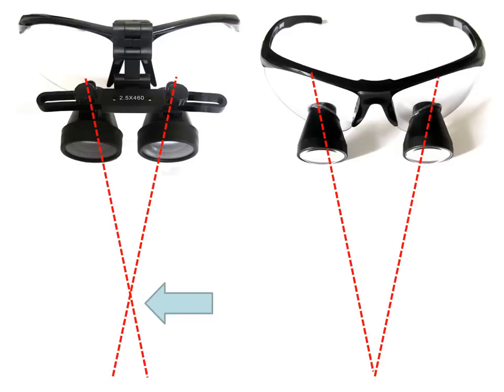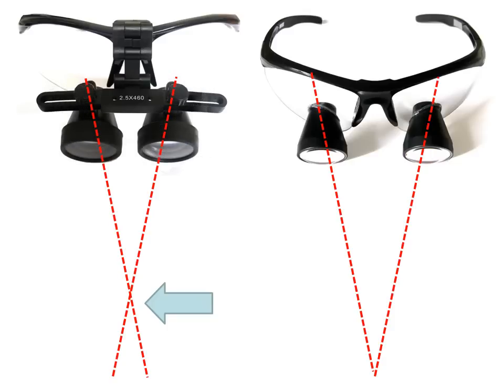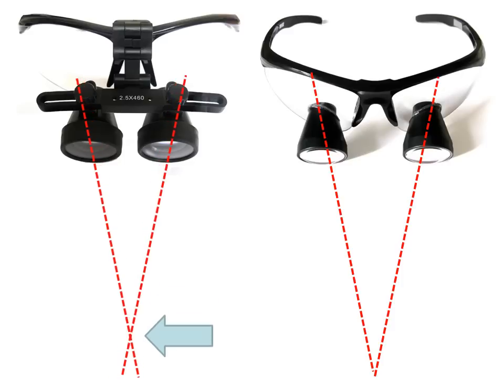A benefit of having an adjustable interpupillary distance is that the working distance can be adjusted to a small degree. As shown in the animation, by moving the loupes outwards and inwards, it's possible to fine-tune the exact position that the loupes are focusing.